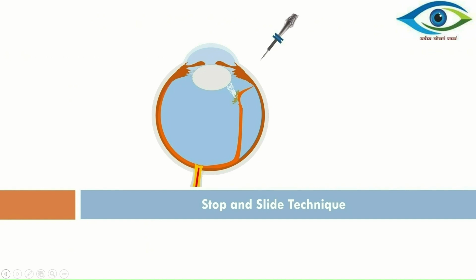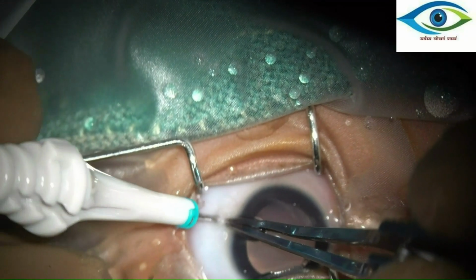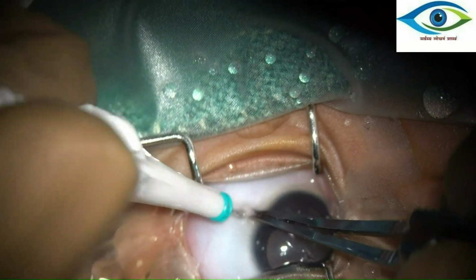In the stop and slide technique, once the initial part of the cannula engages partly into the sclera, a forceps is used to push the cannula inside further, while the trocar is withdrawn from there itself. This way, a shorter length of trocar enters the eye, reducing the risk of retinal injury. This short video shows the stop and slide technique of trocar and cannula entry.